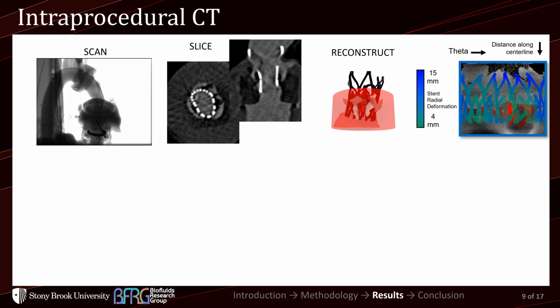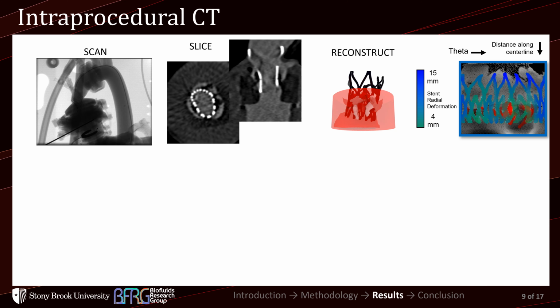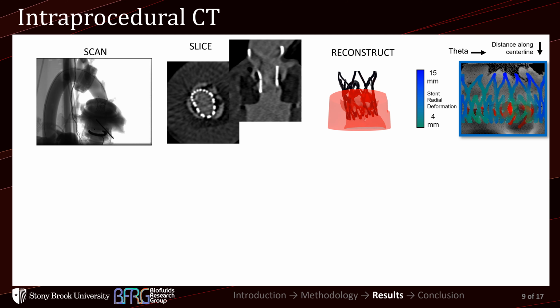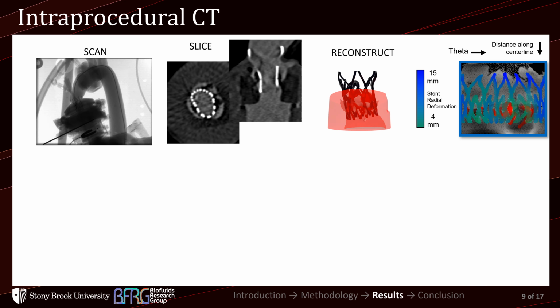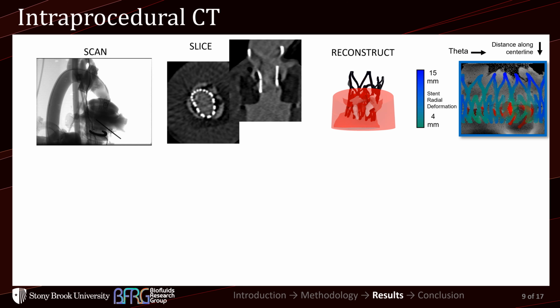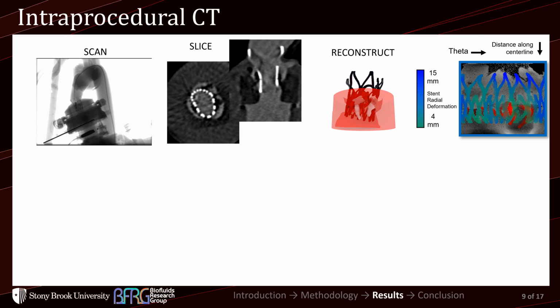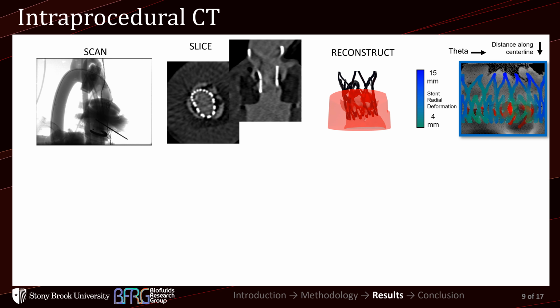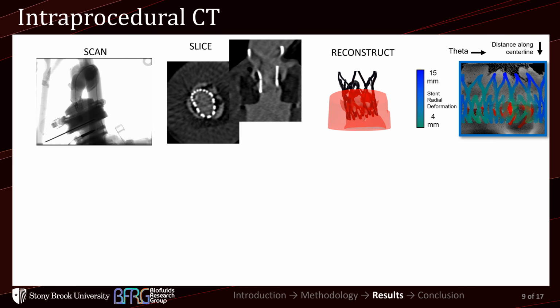So that means either a refined stent structure or a more rigid frame, maybe adapting from the nitinol frame to a cobalt chromium frame going to a balloon expandable valve. The point is, during this process, we now know how it's going to benchmark inside the patient, and we can now adapt and change it.